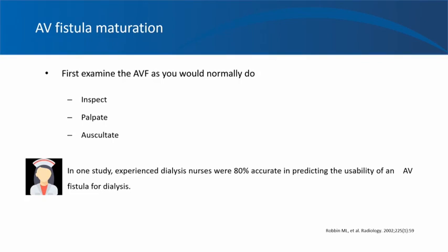And auscultation. It's helpful to listen to the bruit to determine the character of the diastolic component. The bruit should have a low rumbling pitch with a prominent diastolic component. With progressively increasing resistance, as with stenosis, this component occurring at the lowest pressure in the cardiac cycle will disappear first, and the lesion is present more downstream, that is in the direction of flow.